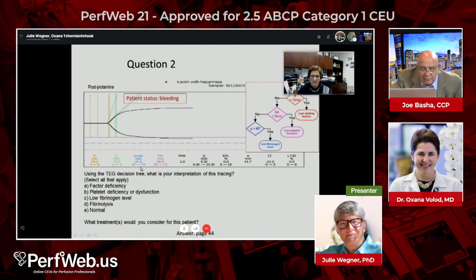Let's see, I can't read that right there. The green one, what's that right there? The green. It's a little elongated. It's 4.3 with 4 as the upper limit. Okay, so that's also a little long, and yep. The angle seems too shallow to me.